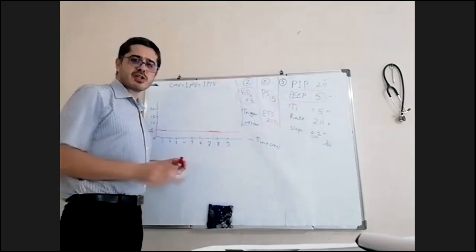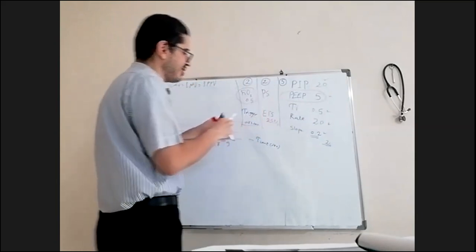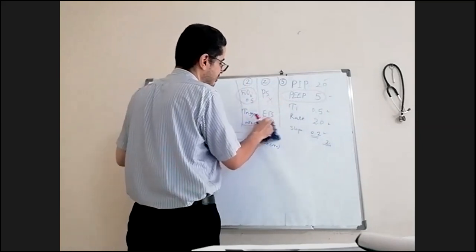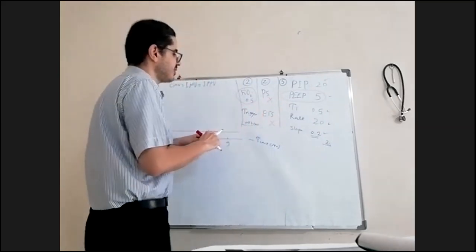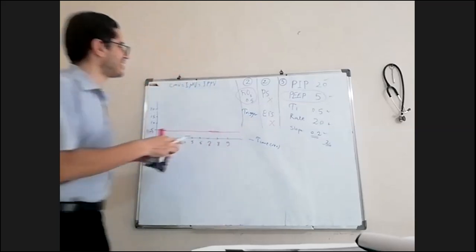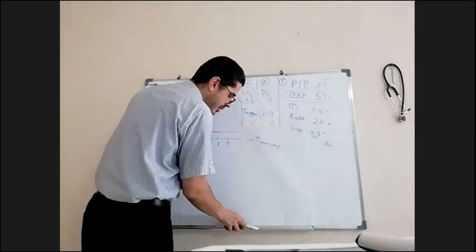Do you think there is pressure support? No. Very good, there is no pressure support. Do you think there is ETS? No ETS. Very good. Do you think there is trigger? No trigger. This is a tough mode which is not used now. This one does not look at the patient at all.